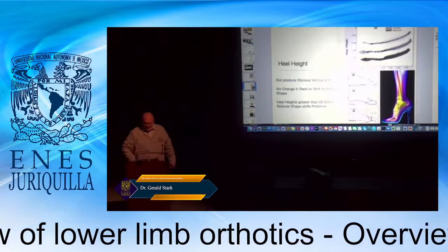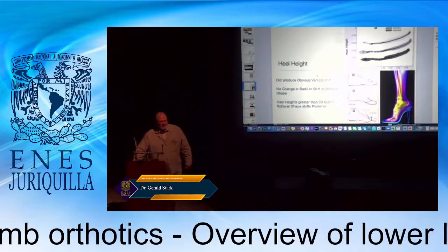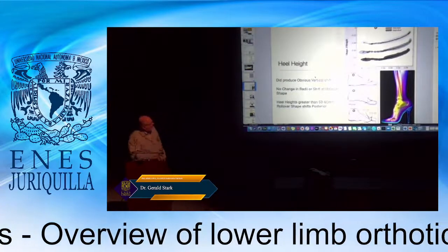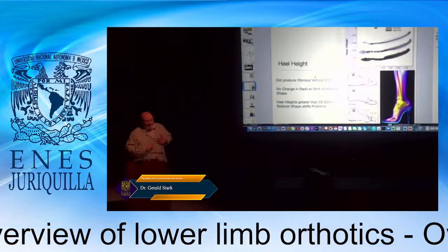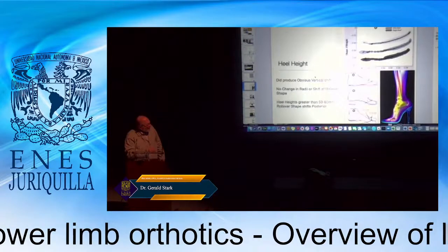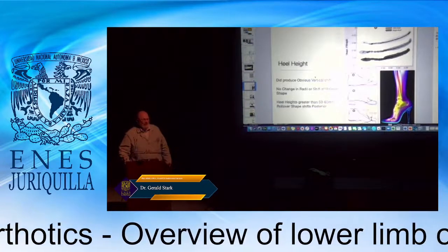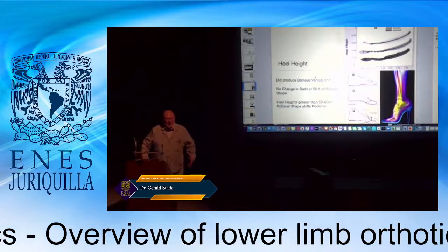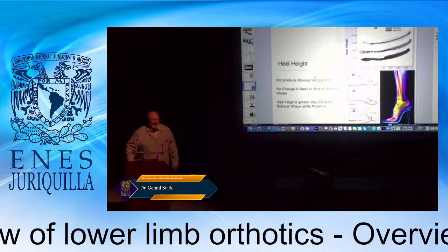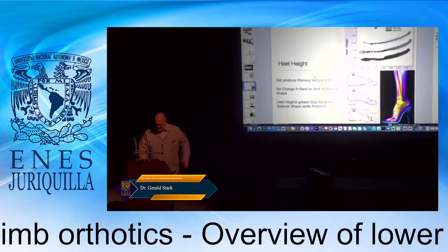So when we look at this type of thing in rollover shape, heel height actually had no effect either. In fact, all heel height did was limit the amount of the effective foot length. That's why I don't wear high heels, but if I did wear high heels, the rollover shape is the same, but it makes your feet and your calf muscles work harder. In fact, because they're working so hard, that's part of the effect. But we know in terms of trivia, high heels originated in Venice for men, by the way. So that's kind of interesting.